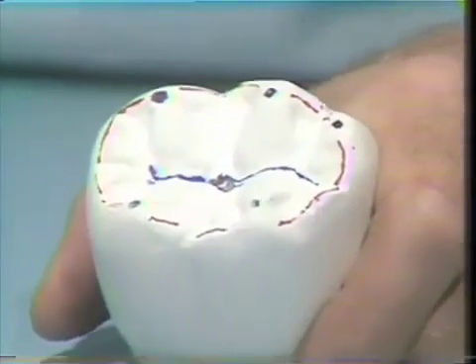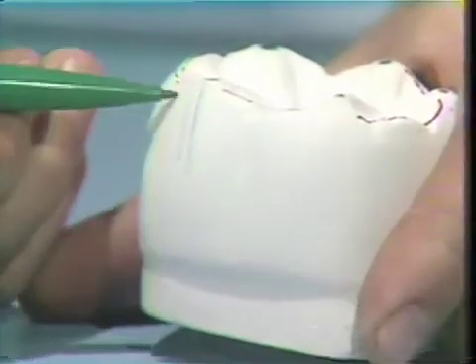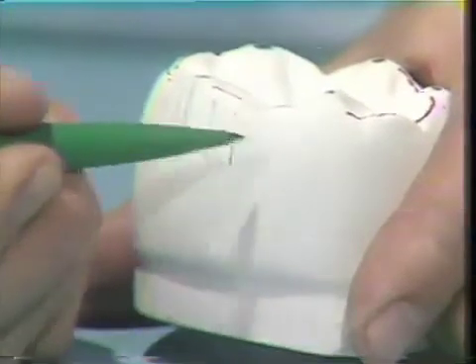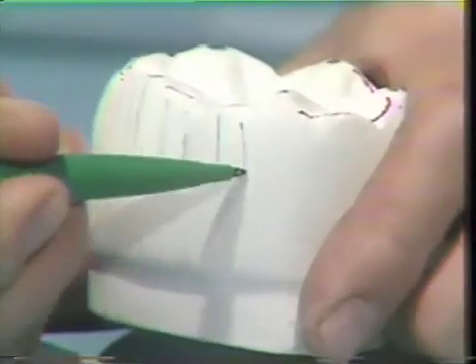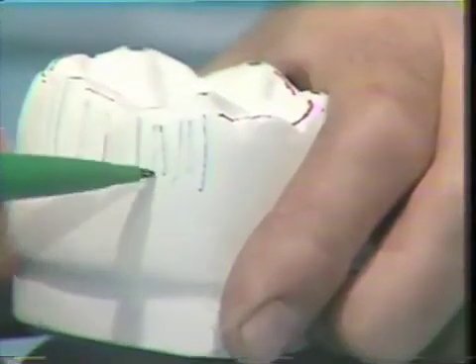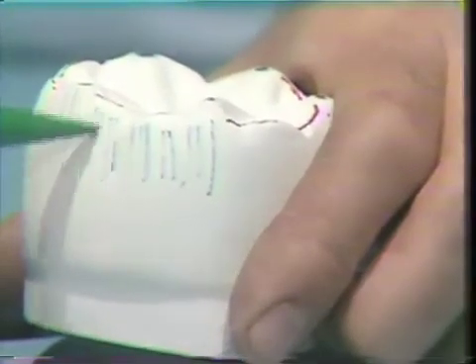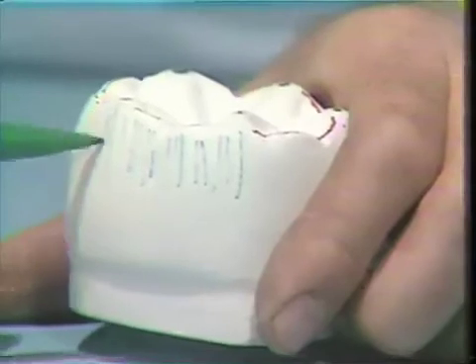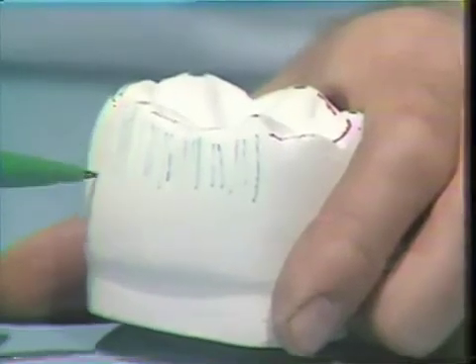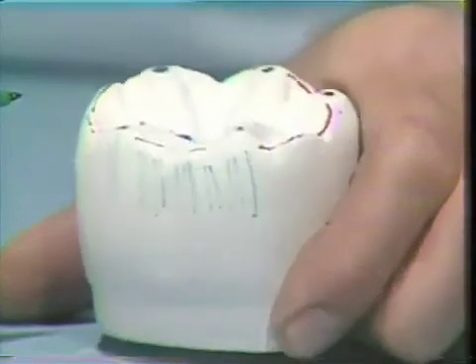Next, we have the axial contours of the tooth, which will probably extend down to an area in this area, where we will begin to pick up the contour of the residual of the preparation and blend this into the marginal area. This is also extremely important, although it doesn't play a particular role in the function of the tooth. It does throw the food off of the tooth surface and stimulate the gingiva so that we have a healthy overall dentition.